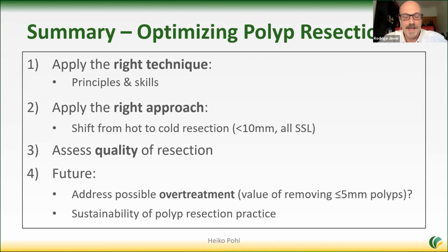Quickly, Heiko, three questions in the same direction. Do you think cold snare resection is also okay for polyps with suspected high-grade dysplasia? Well, personally, I think yes.